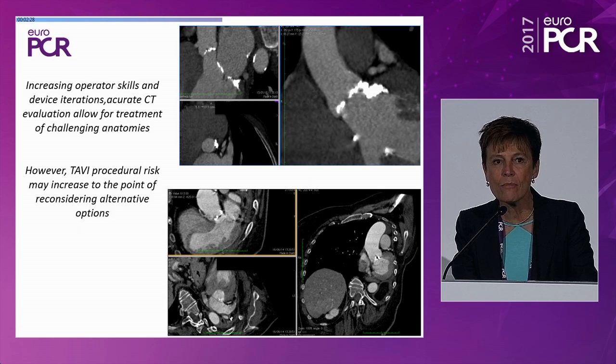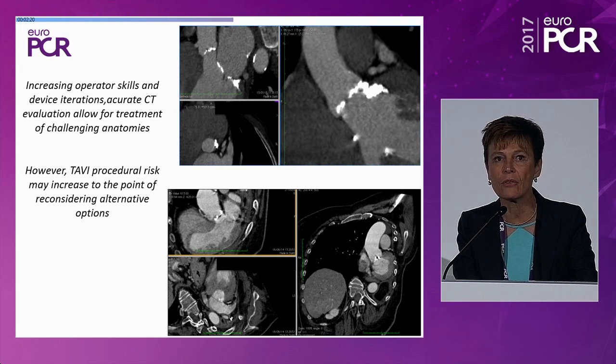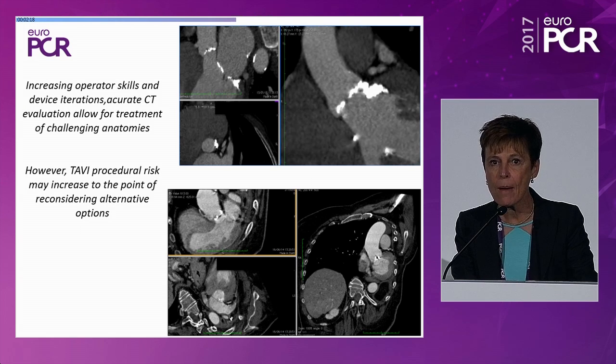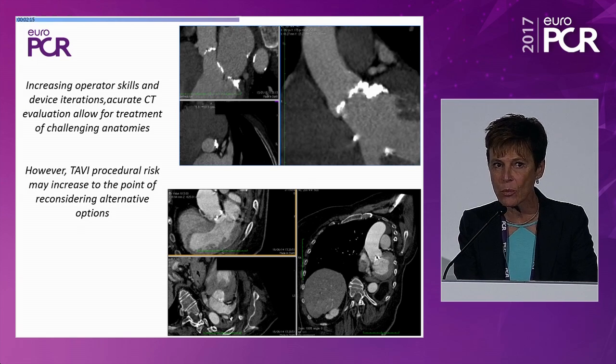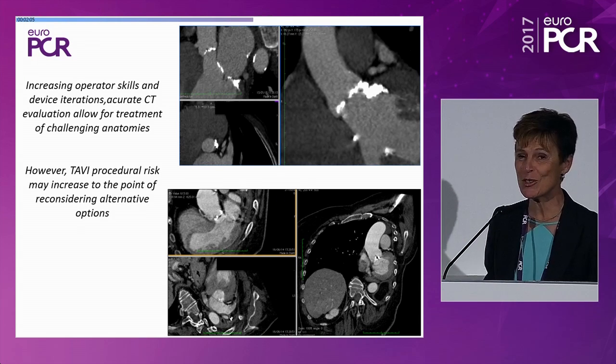We are getting more skilled, and we have done more TAVI now, and we are able to plan what the result of our procedure will be. But now that we are facing intermediate risk patients, perhaps sometimes we should stop, look carefully at what we are going to do, and sometimes call the surgeon again.